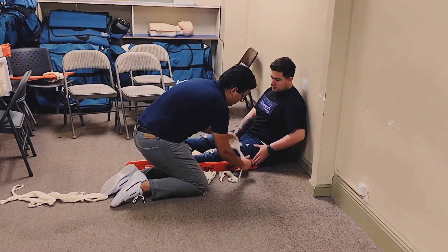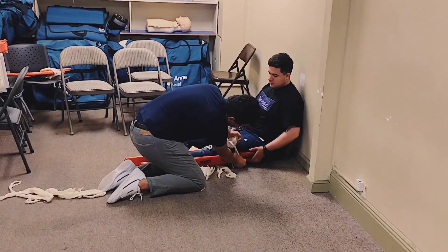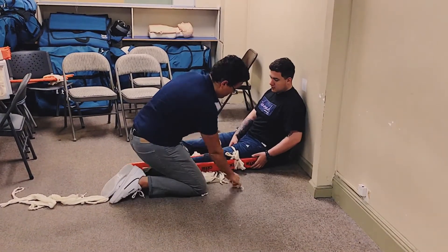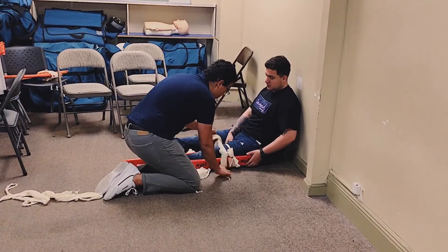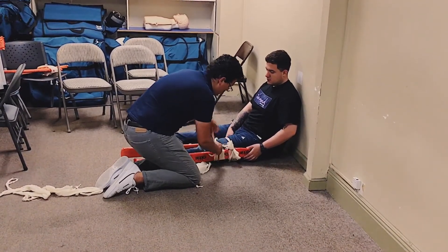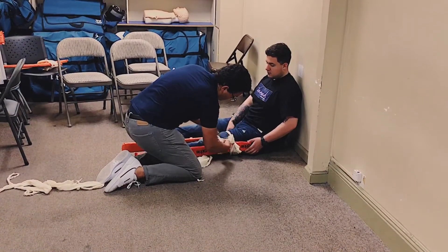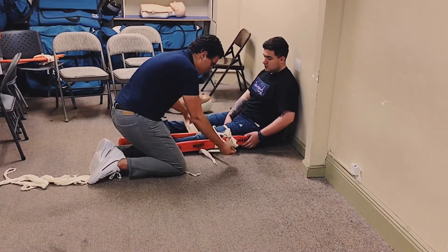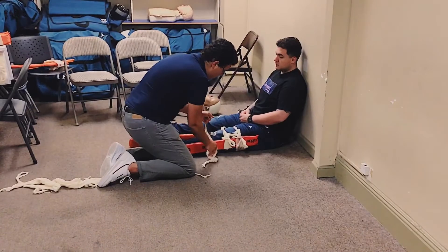I'm going to go ahead and use the loop method — make one tail smaller and then pull the longer tail through. Again, making one tail smaller, pulling the longer tail through, making sure I'm above and below the knee, not tying on the knee.